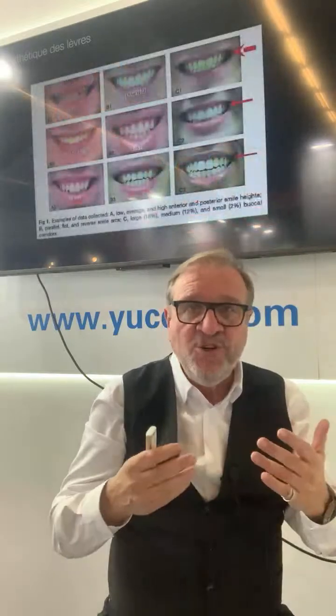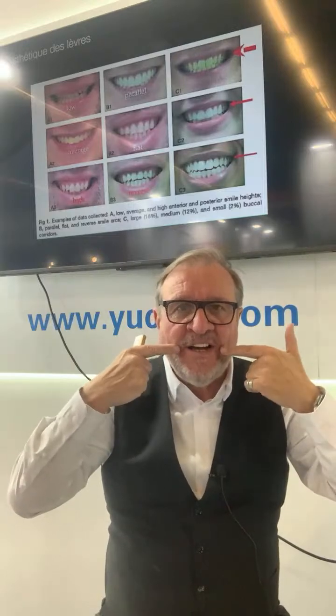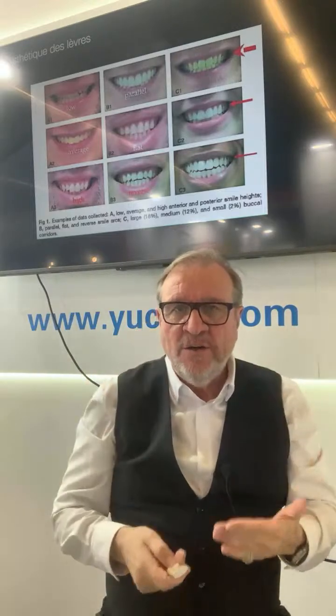After, you have to be careful about the aesthetics of the lips, and this helps you see how big the smile is and where the edge of the smile is, here or here, and that makes your good proportion.